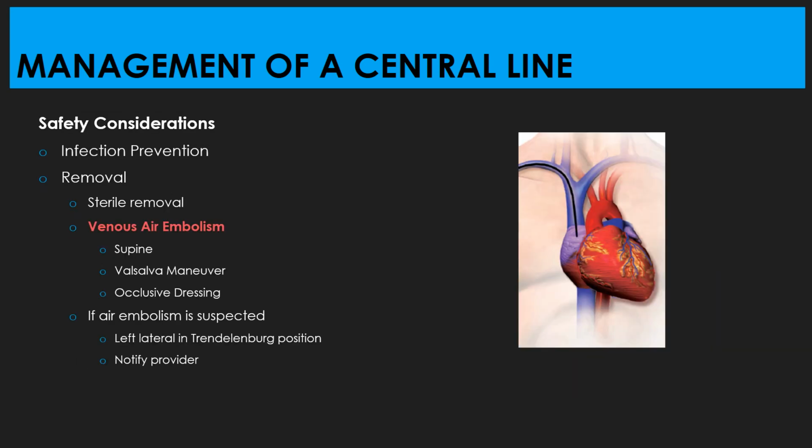Okay, some safety considerations with a central line. Infection prevention is huge with central lines. So I want you to take a look at that photograph on the right. The catheter tip of the central line is in the superior vena cava, and it's right above the right atrium.